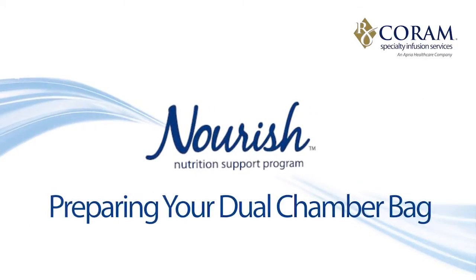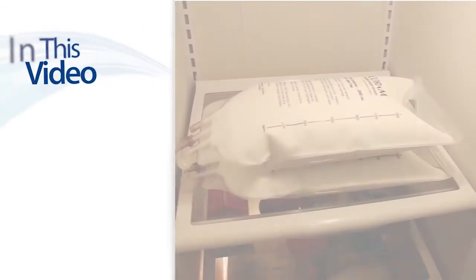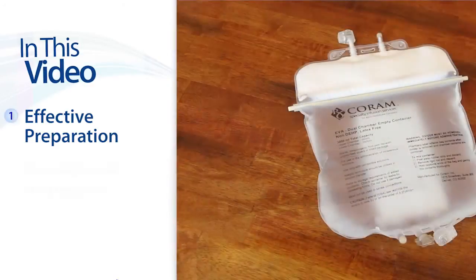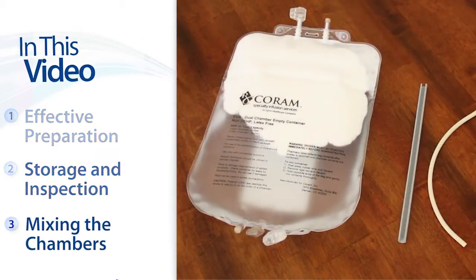The following tutorial will show you how to prepare your dual chamber bag. This tutorial includes the following sections: effective preparation, storage and inspection, and mixing the chambers.